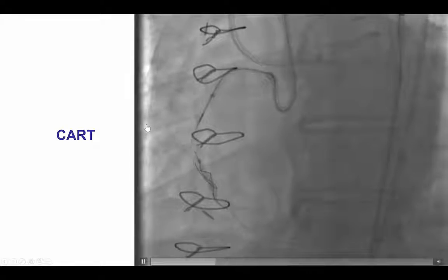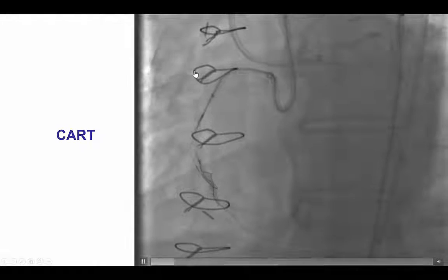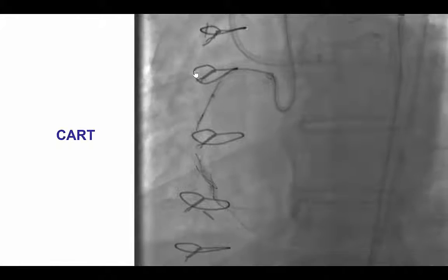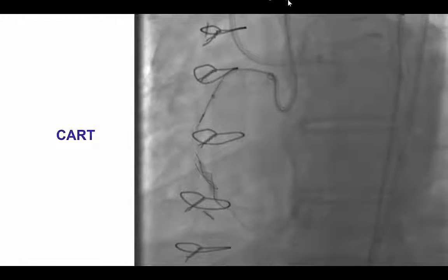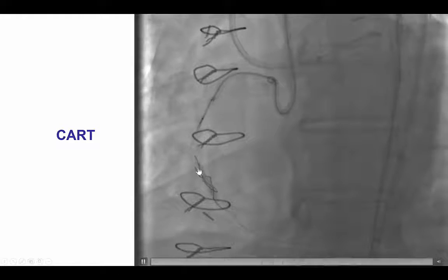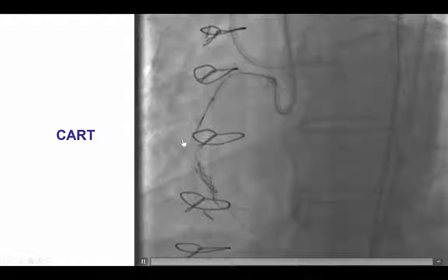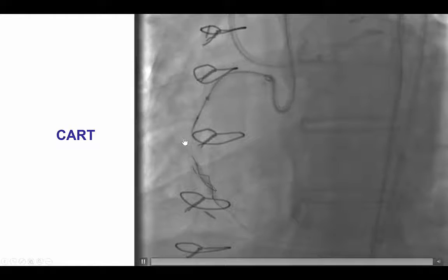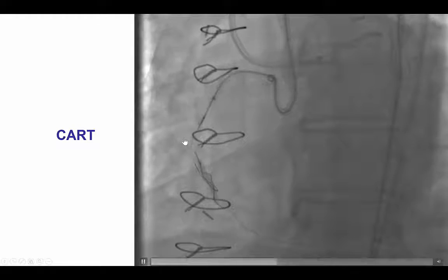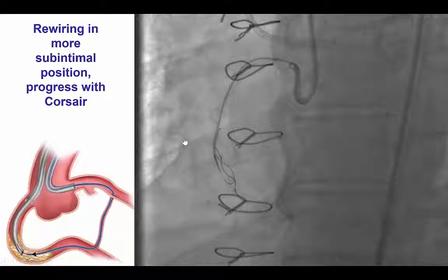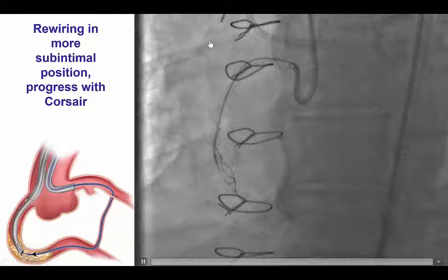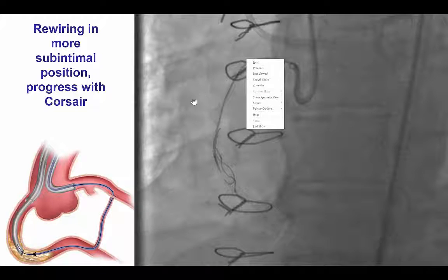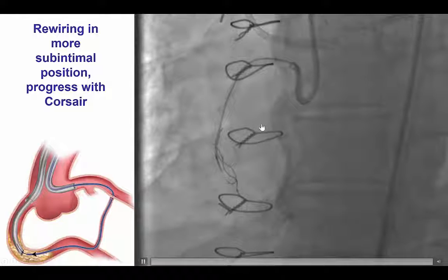Given the difficulty advancing equipment distally, we tried the CART technique in which a balloon is inflated over the retrograde wire and we attempt to cross in the antegrade direction; however, CART was not successful in this case. We also attempted guideliner reverse CART, trying to get a retrograde wire into a guideliner; however, this was not successful either.